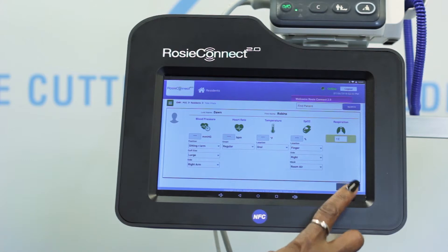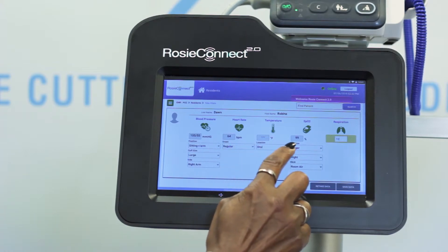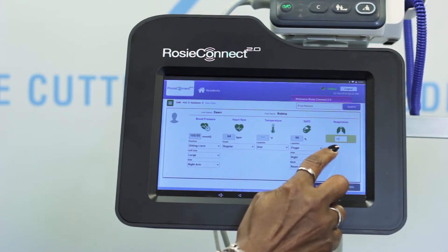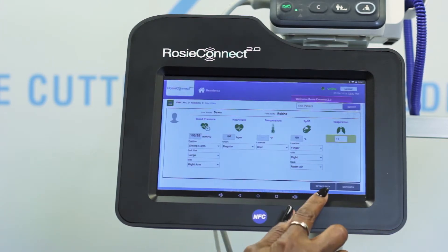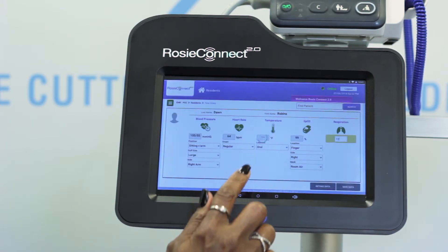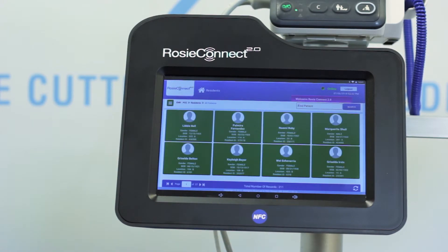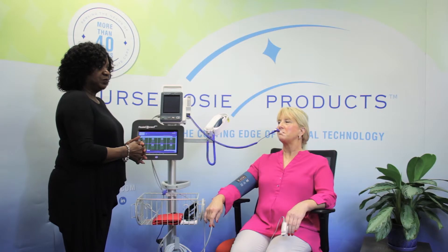At this point you are ready to get all of your data to pull from the monitor to the tablet. Select Get Data — once you have selected it, it brings all the information down from the monitor to the tablet. If the resident's clinical data is within the correct parameters, select Save Data. If not, there is a retake option — simply retake the vitals and then select Save Data. A box will pop up to ask if you wish to save the data. Select yes to close out of the resident and it will automatically return to the all patients screen, or select no to return to the take vitals page to retake.